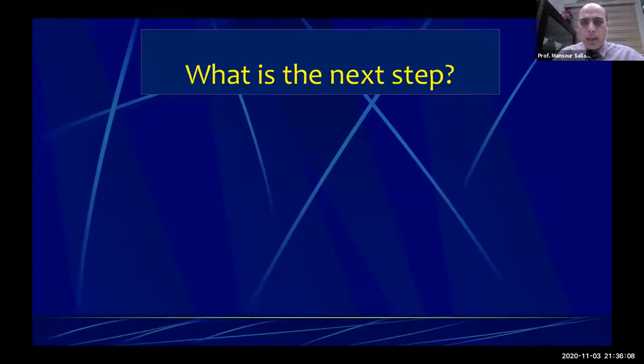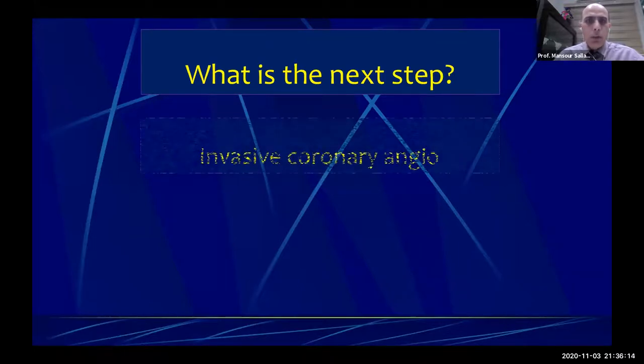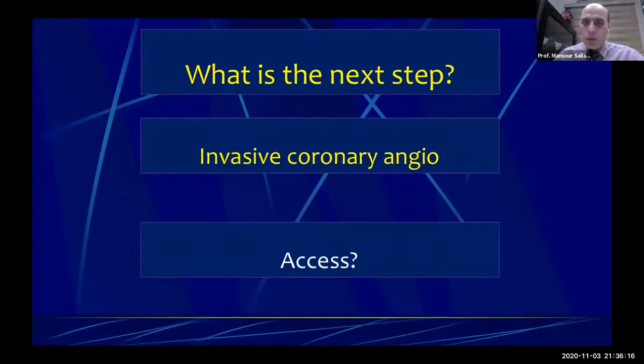I think exactly as you mentioned, Dr. Hatem, I have nothing except to do invasive coronary angiography to demonstrate what is going on. So invasive coronary angiography, what do you think? What is the best access for those patients?